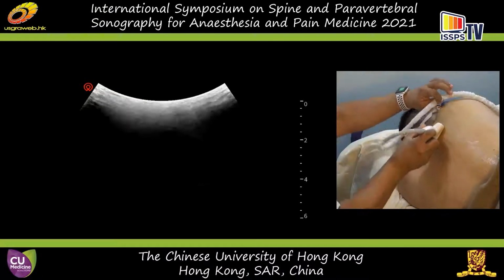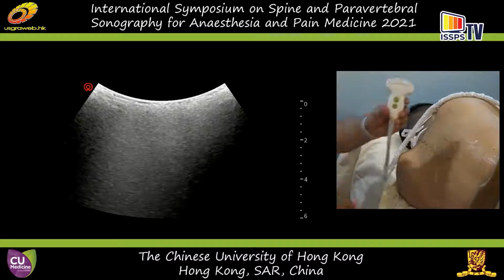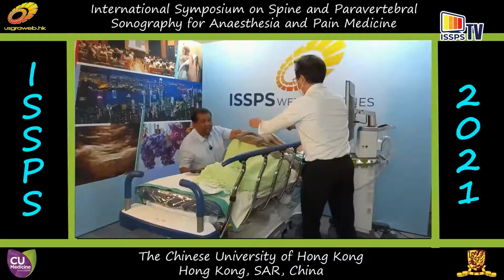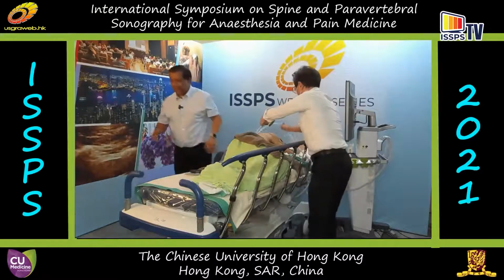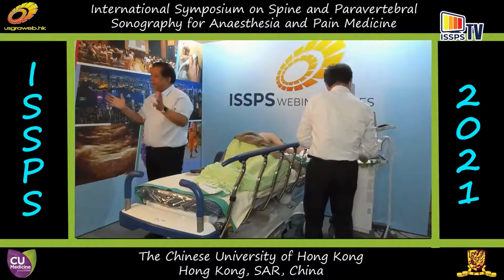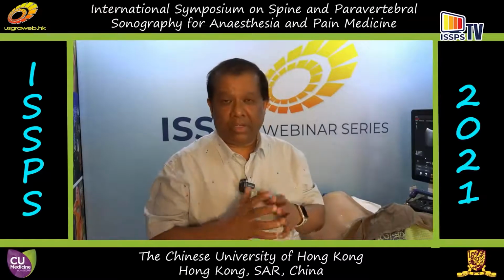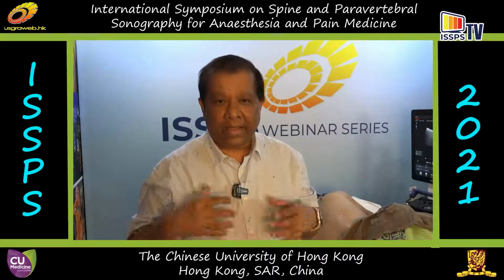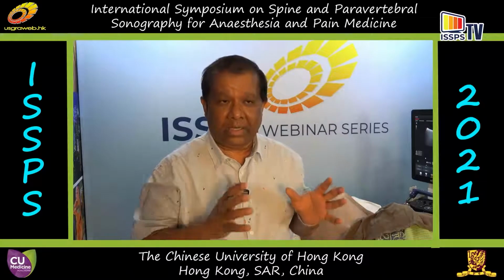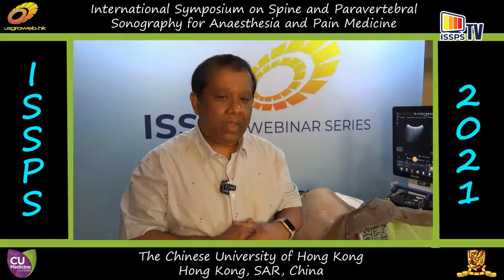epidural space. Okay, so I think we've had quite an extensive discussion. We've demonstrated to you. Let me go to F1. So I have demonstrated to you the sonoanatomy relevant for paravertebral blockade. I've also shown you how you can use ultrasound to identify the anatomy relevant for thoracic epidural, particularly the paramedian. I did not go into showing you the transverse scan because it's not really very useful when you're doing it for intervention. It can be useful as a pre-procedural scan.